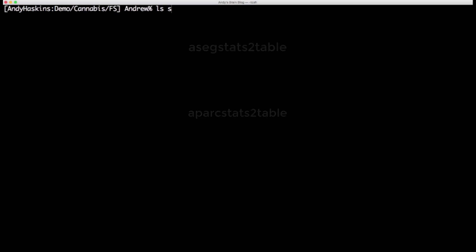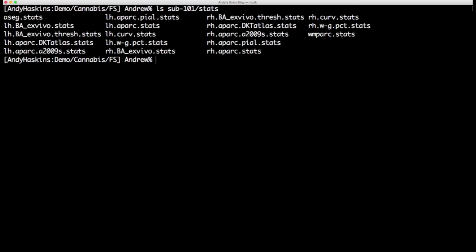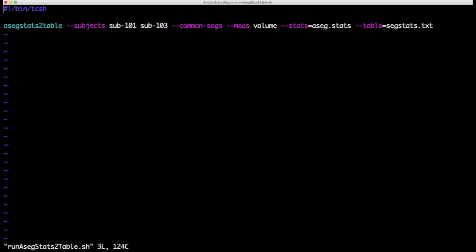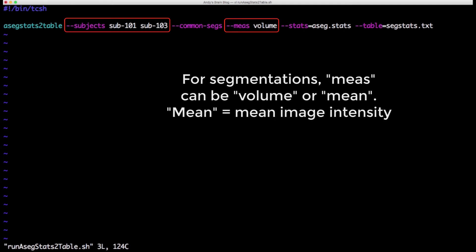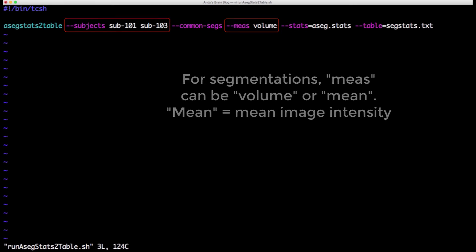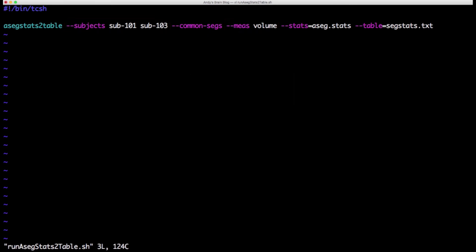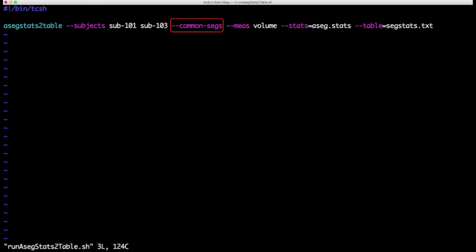Let's begin with aseg stats to table. You need to specify the subjects as well as which measurement you want to extract. For subcortical segmentations, volume is usually the only one you will want to look at. You then give it the stats file you wish to extract from and an output file.